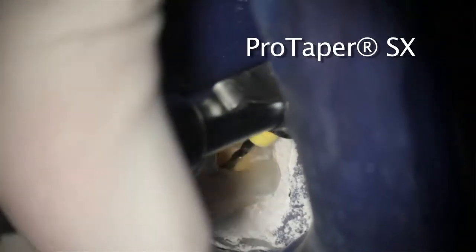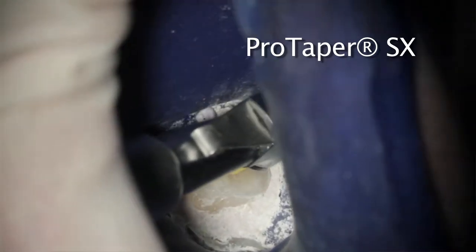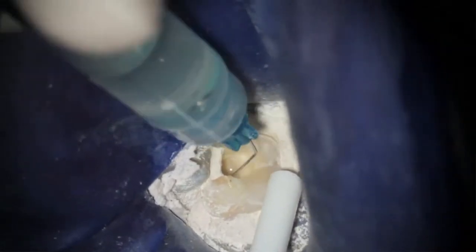As I mentioned, the coronal access is important. I am using the ProTaper Shaper X file. I get great straight line access with this file. The debris pattern is just in the coronal and mid-root area of the file. Irrigation is critical throughout the procedure.